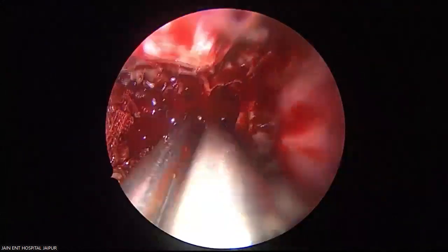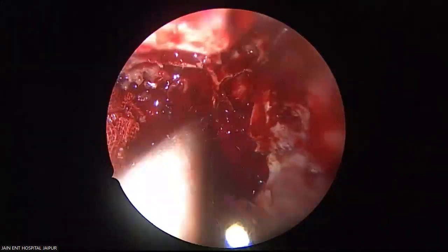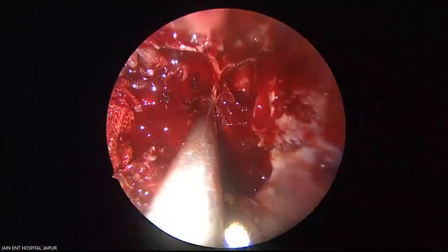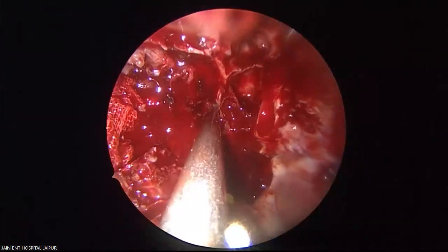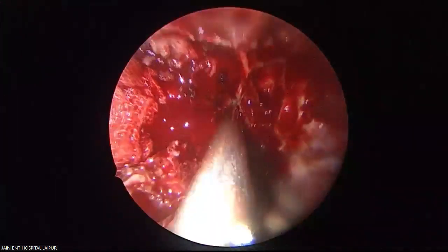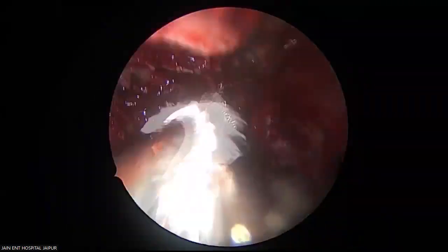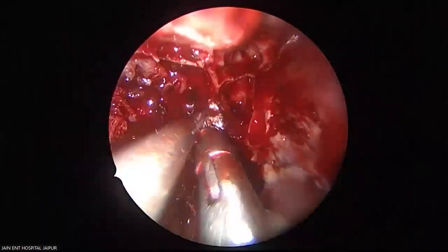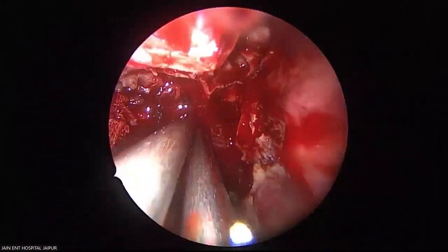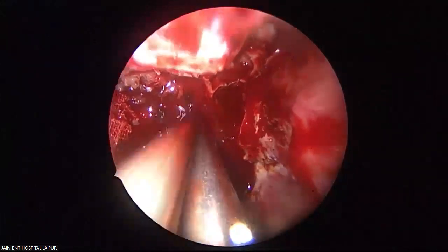This is all venous bleeding, a little bit, which will control anyway. Surgical break. See, I'm looking for a small piece of Surgicel. Yes, push this. Now with the gauze. Suction gauze.